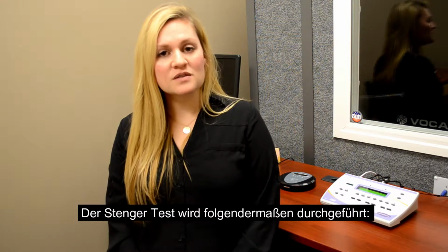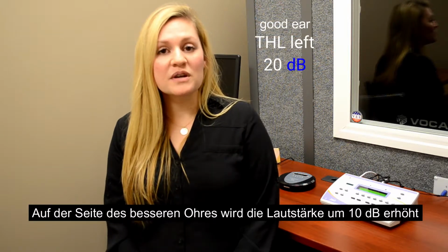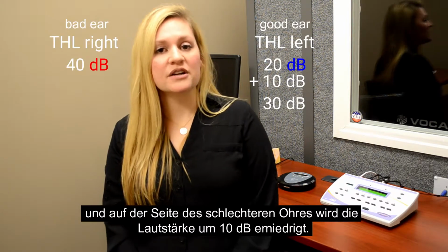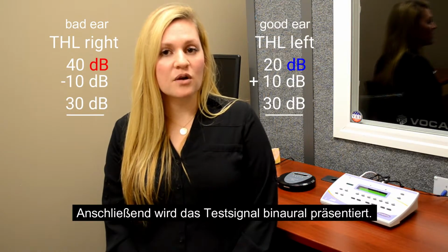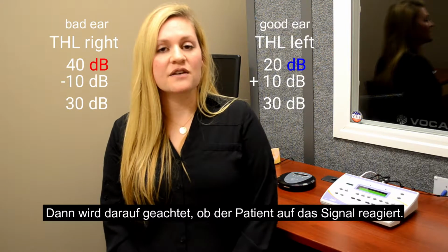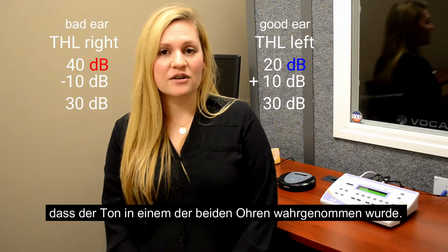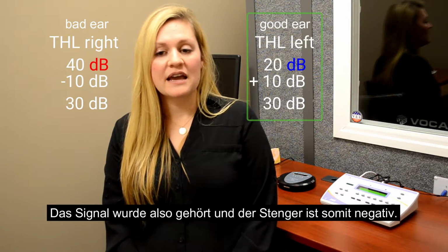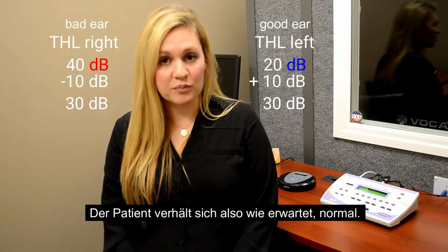To perform the test, what you have to do is the side that has the better hearing, you would increase it by 10 dB, and the side that has the worse hearing, you would decrease it by 10 dB. And then you would present the signal in both ears and see if the patient responded. If the patient responded, that means that they did hear the sound in one of their ears and they're responding to it, and that would be a negative Stenger, which means that they are responding appropriately.